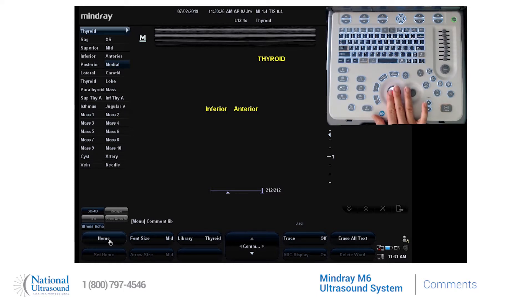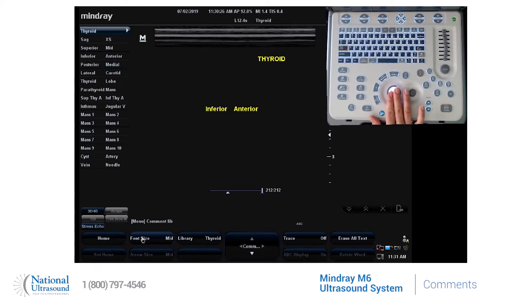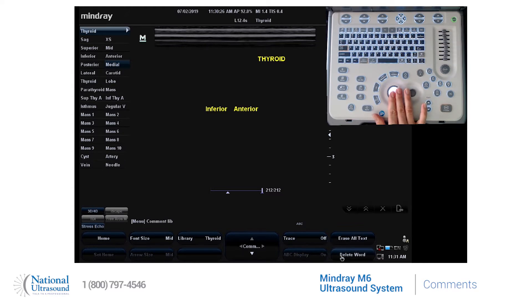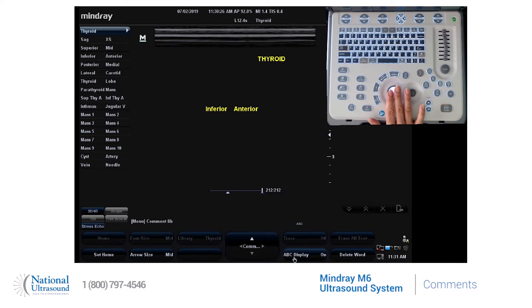If you want the cursor to go back to the home position, you would press home. If you want to reset the home position, use the set home button. You can adjust the font size, erase all text, delete a word, or toggle ABC display on or off.